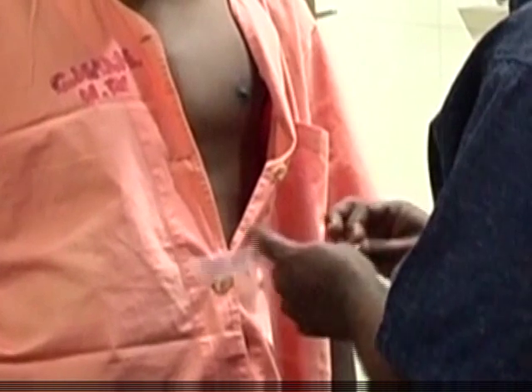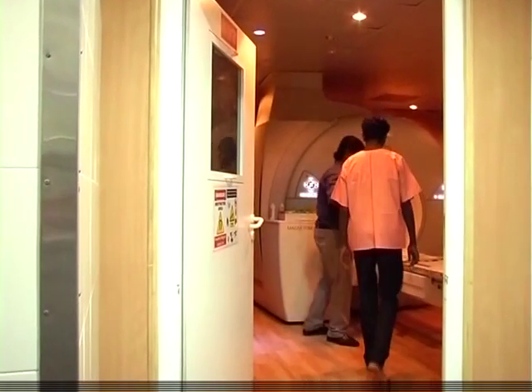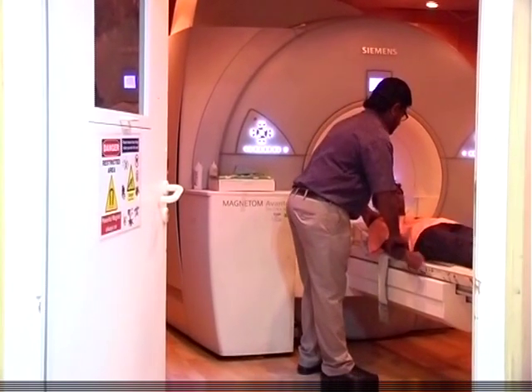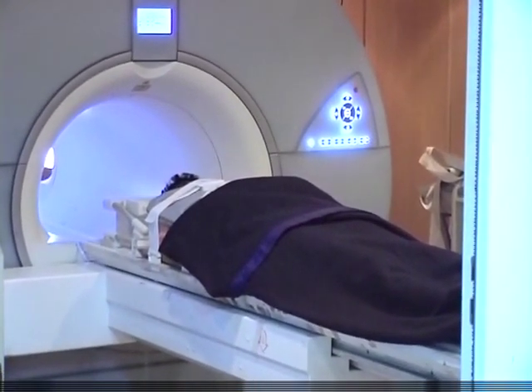Three ECG electrodes are placed on the chest after shaving. The patient is entering the cardiac MR suite and is asked to lie down on the table. The ECG electrodes are connected to a Bluetooth device and there is a respiratory bellow for respiratory monitoring. An 8-channel cardiac MR coil has been placed over his chest, and the patient is covered with a blanket and placed inside the gantry.